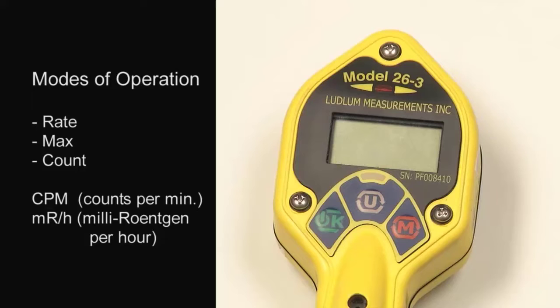We are now ready to use the detector. There are three modes of operation available for the Model 26-3: Rate, Max, and Count. The user should select CPM when not using the dose equivalent filter, and mR per hour when using the dose equivalent filter. CPM stands for counts per minute, and mR per hour is milliröntgen per hour. Both are commonly used radiation units in the United States.